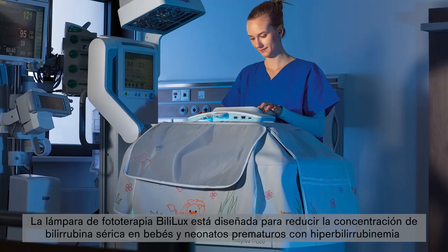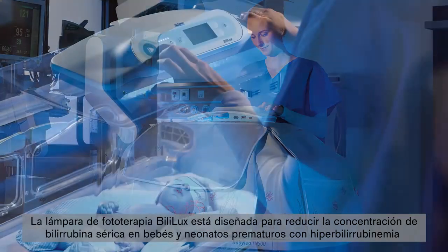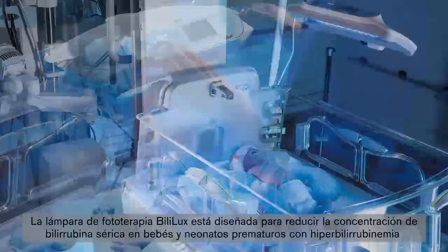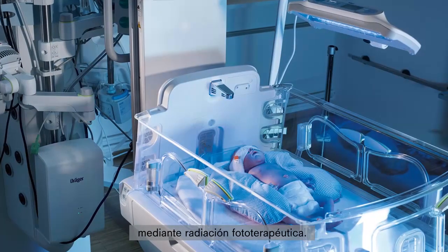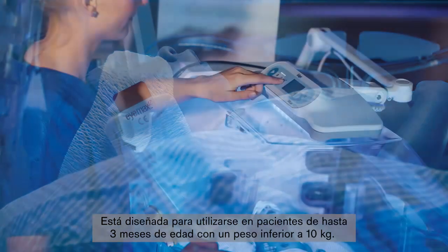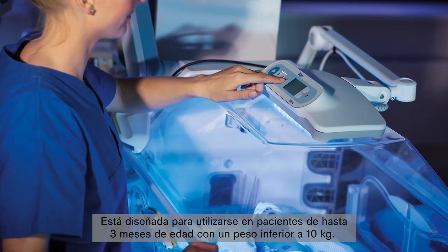The Bililux Phototherapy Light is designed to reduce the serum bilirubin concentration in premature babies and neonates with hyperbilirubinemia by means of phototherapeutic radiation. It is intended for use with patients up to 3 months of age who weigh less than 10 kg.